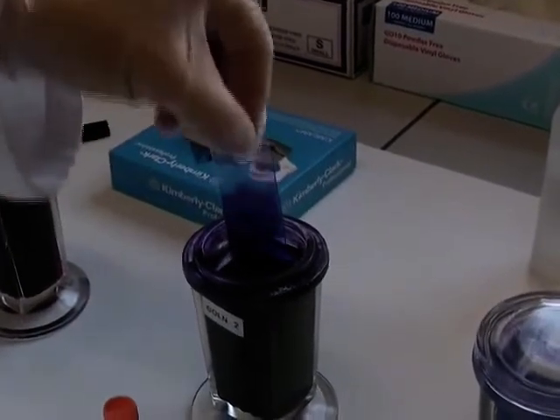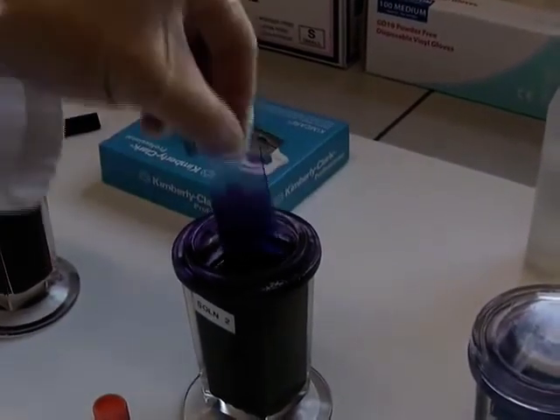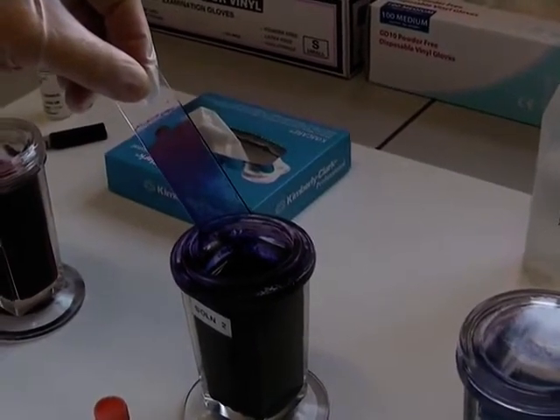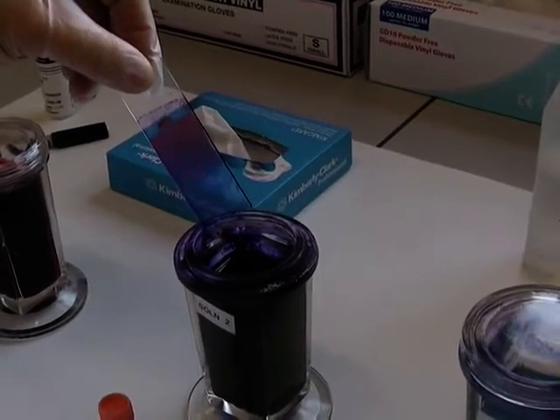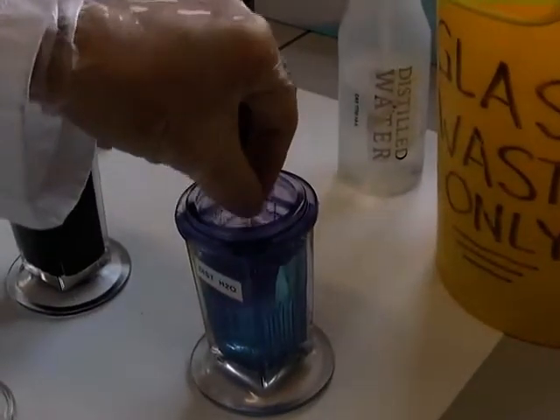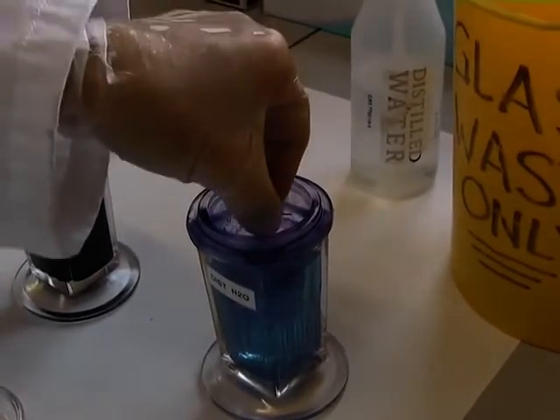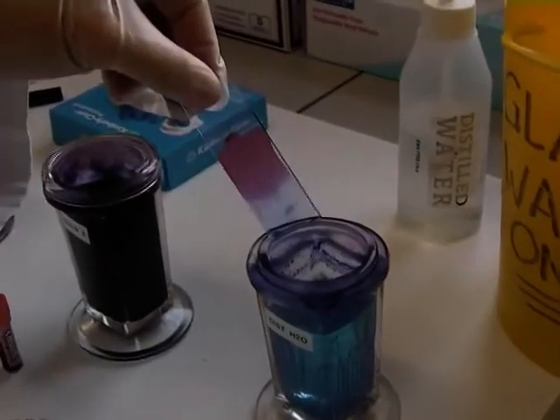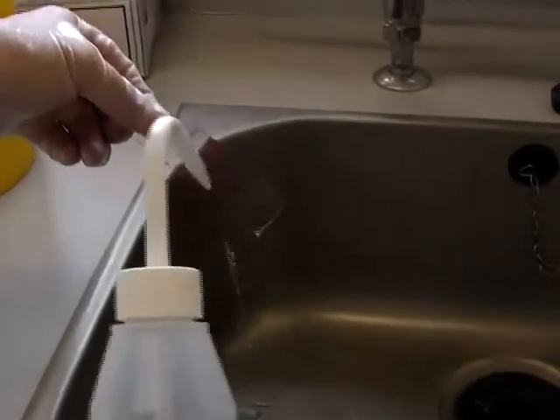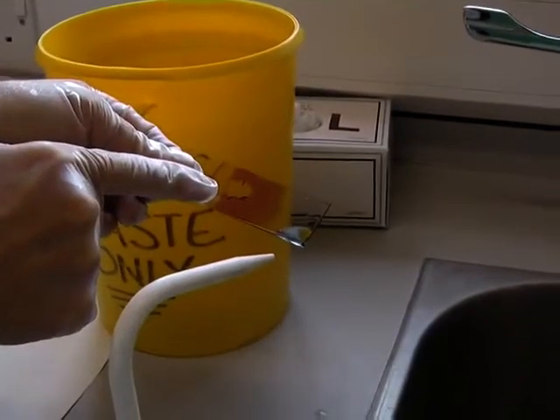And finally, you can either dip it in a coplin jar of distilled water to clean it, or you can use distilled water to clean it directly. But as you can see, there is a possibility of losing some of your sample with that method.